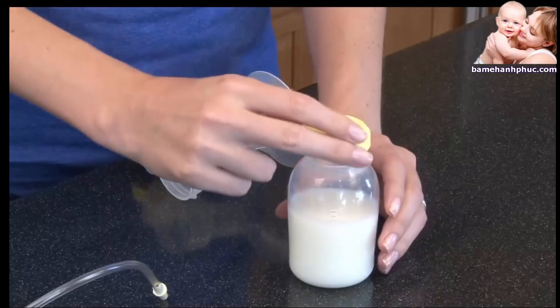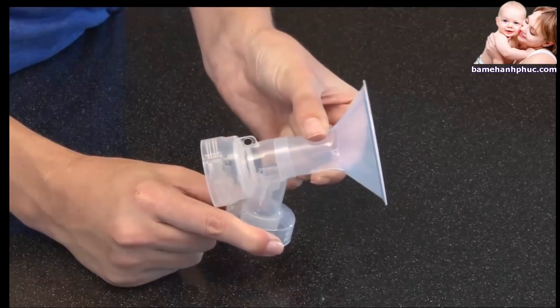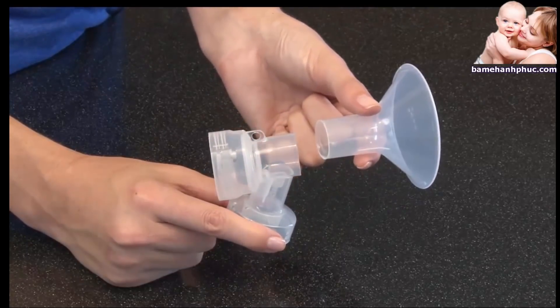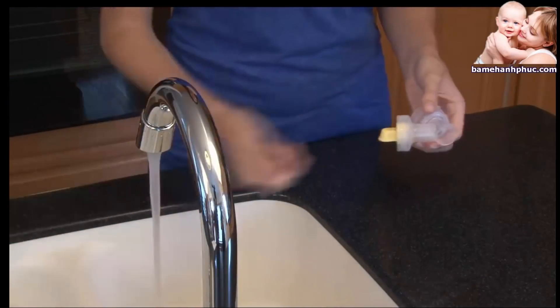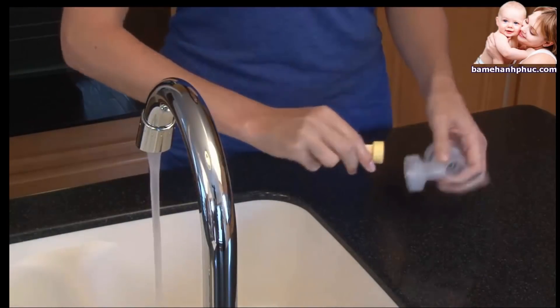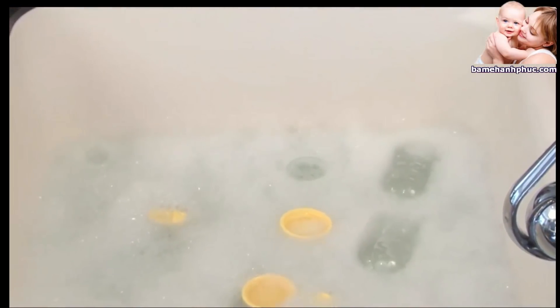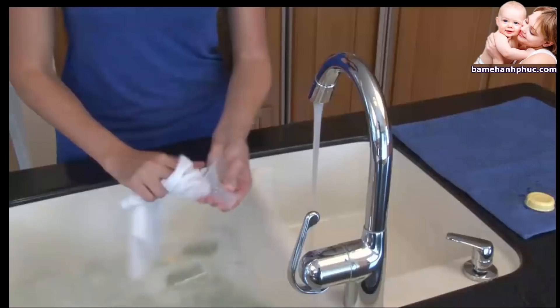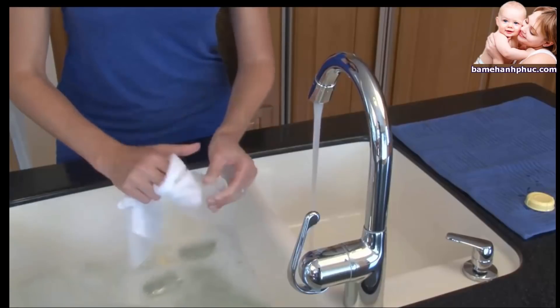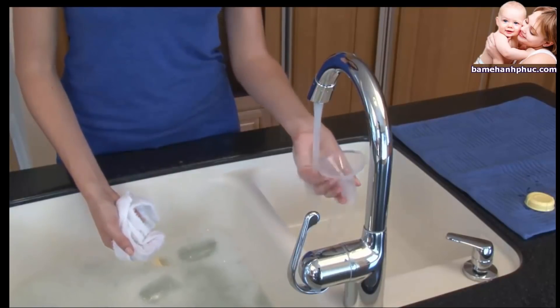After each pump session, store your breast milk, then disassemble and separate all parts that come in contact with breast milk. Rinse the parts in cool water to remove breast milk residue. Then, using a mild dish detergent, fill the sink with warm soapy water and allow the parts to soak for five minutes. Wash all separated parts with a clean dish cloth or a soft brush and rinse in cold clear water.